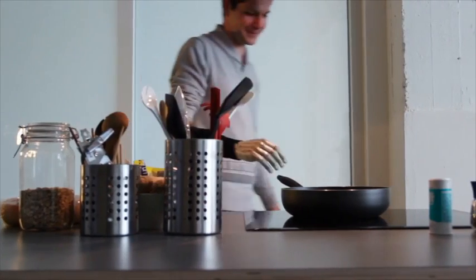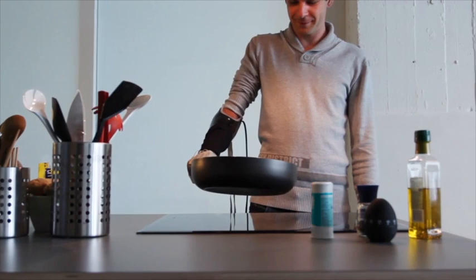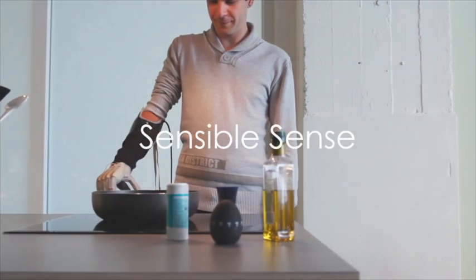The important thing for me to know when I'm using the hand is an indication when I'm touching something, and to know that I still have a secure grip. Also, when I'm holding an object for a longer period of time, the vibration fades out and warns me again that the grip changes.